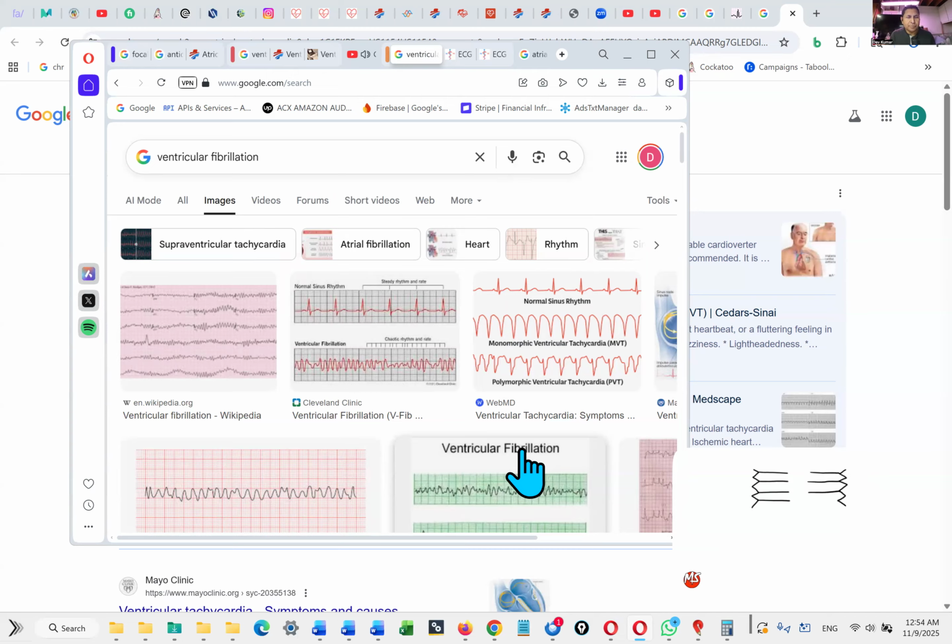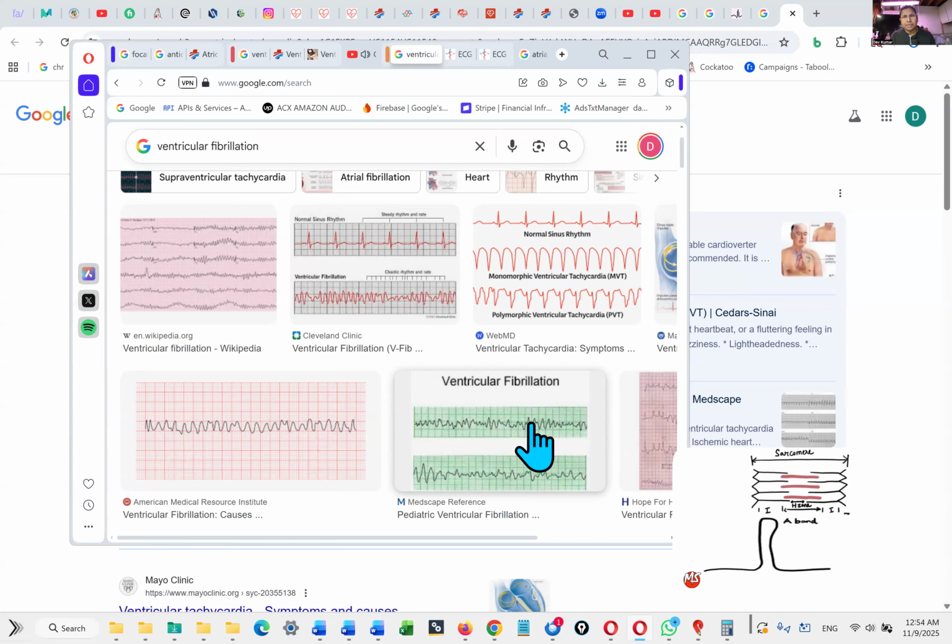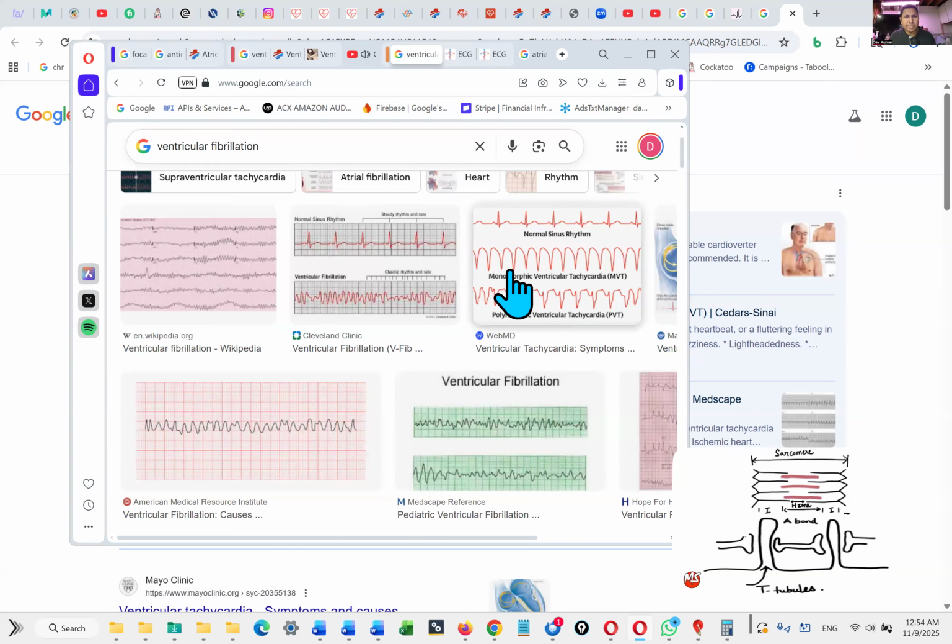So ventricular tachycardia is always wide, right? It's not narrow. Ventricular tachycardia is much wider than that. It has this huge, massive appearance, but regular. See, this is ventricular fibrillation because there are big waves, but there's no uniformity. Ventricular tachycardia is very nice and uniform. Fibrillation, there's nothing there. You cannot identify anything. It could be just a kid drawing a line there. See, this is ventricular fibrillation. This is ventricular tachycardia. Even though both are dangerous, with ventricular tachycardia, it's nice and regular.